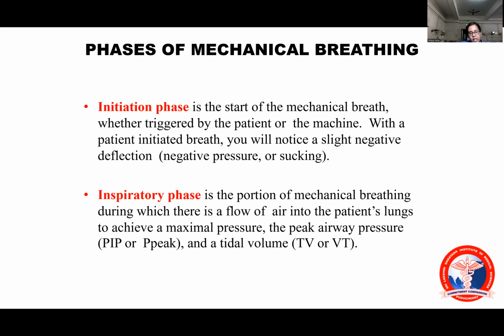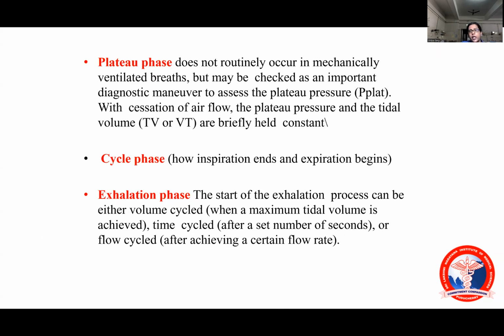Inspiratory phase: it is the portion of mechanical breathing during which there is a flow of air into the patient's lungs to achieve the maximal pressure, that is, peak airway pressure, or a tidal volume, which is required for the patient's ventilation. And something called the plateau phase. Not every mechanically ventilated patient needs a plateau phase, but it is important to prevent barotrauma, because once the plateau pressure starts increasing, the alveoli have to expand, and at one point they may rupture.